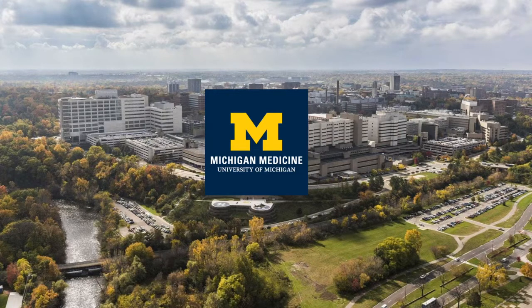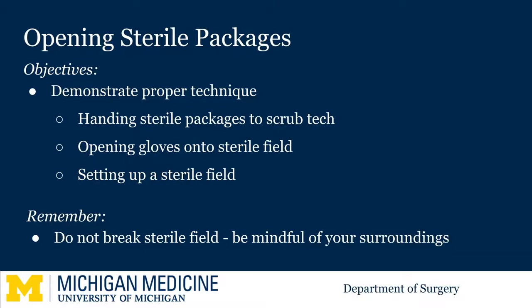Welcome to the University of Michigan Microlearning Program for the Surgical Clerkship. Today we will be showing you the proper technique for handing sterile supplies, such as your gloves, to the scrub tech. We will also walk through how to open your own gloves onto a sterile field, and finally we'll review how to set up a sterile field.